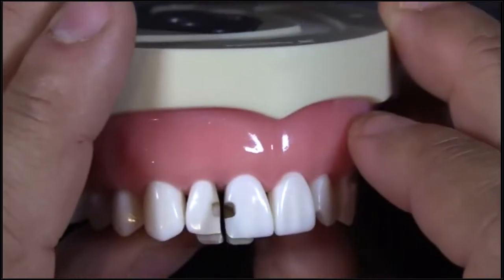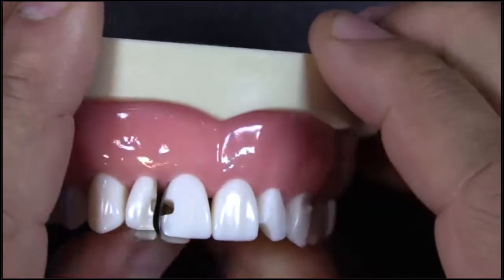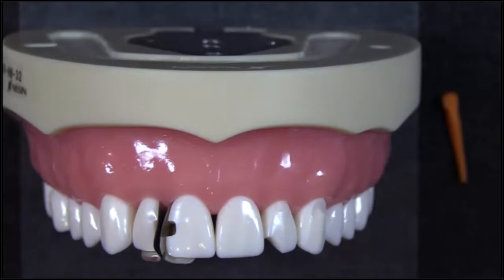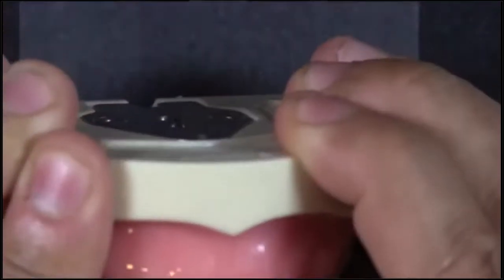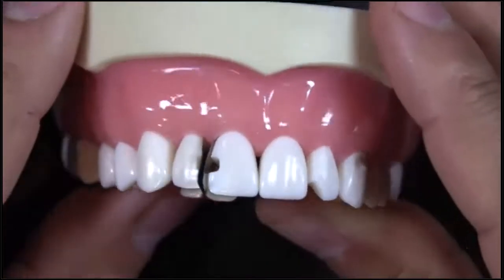just like that. Ever get caught on the prep when you're doing that at all? Or they slide in pretty easily? It's thick enough, or stiff enough, rigid enough, that I can push right through if it's getting caught. I haven't had any problems getting them through, even if I don't break contact. So that's what we end up with here.